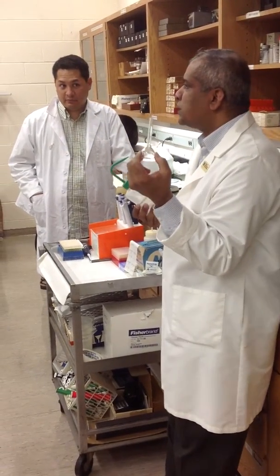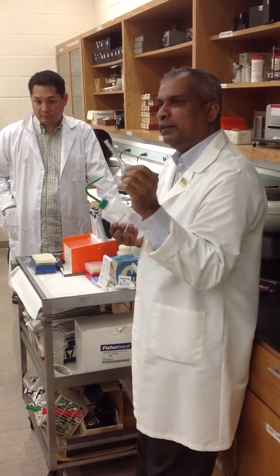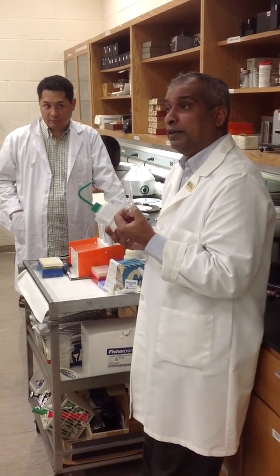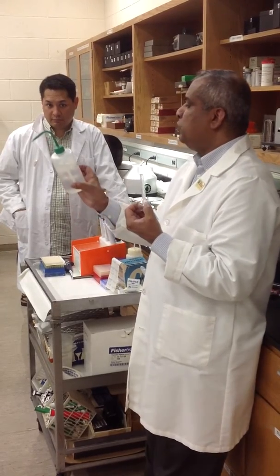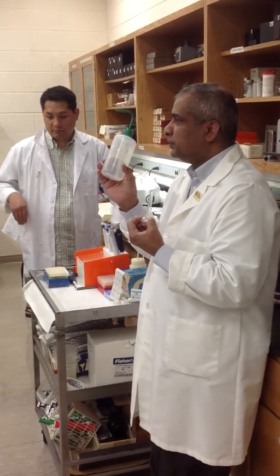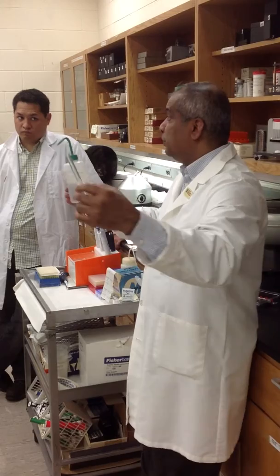If you go to the hospital and you look at a saline, they give people saline. What do you think it's going to say on the bag for sodium chloride? Right. The concentration of sodium chloride in an RBC is 0.85%. So if we make a 0.85% solution, this is said to be what to RBC? Isotonic. Water will be what? Hypotonic, which will cause the RBCs to swell and burst, like he said.